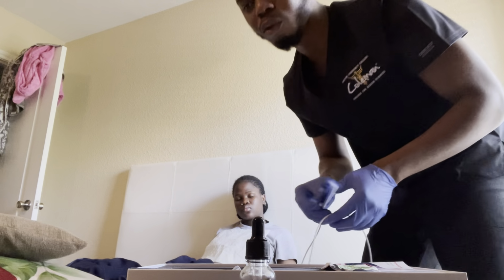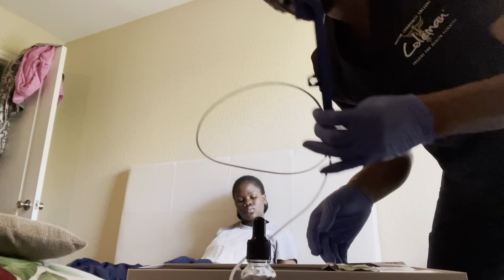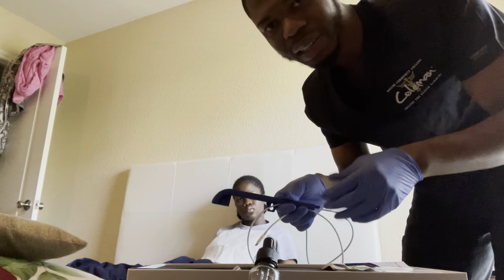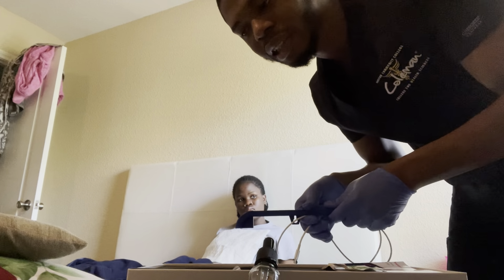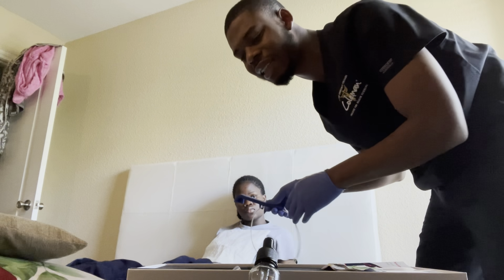The general rule used when performing nasopharyngeal suctioning in adults is to insert the catheter about 16 centimeters. In older children, insert it about 8 to 12 centimeters, and in infants, we should insert the catheter about 4 to 7.5 centimeters. And this is an adult, so I have to insert it about 16 centimeters.